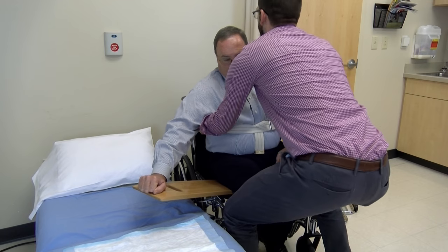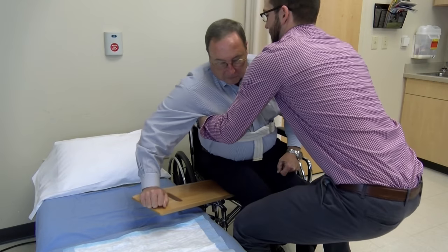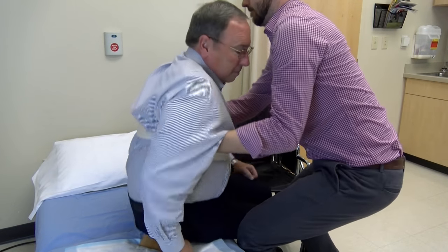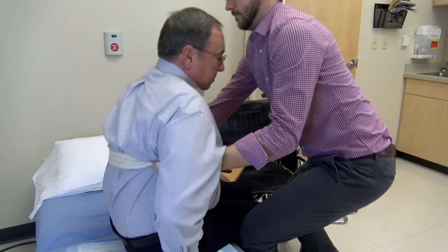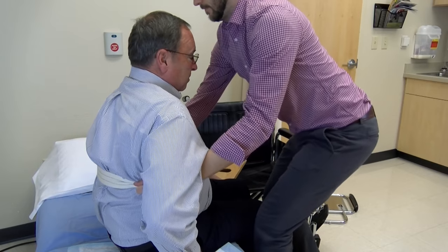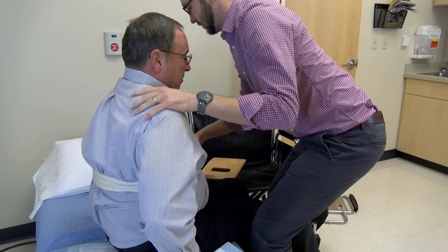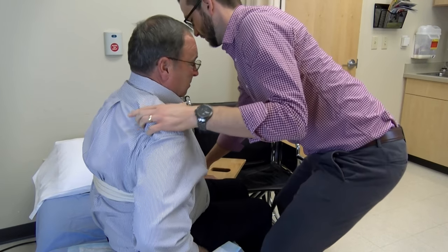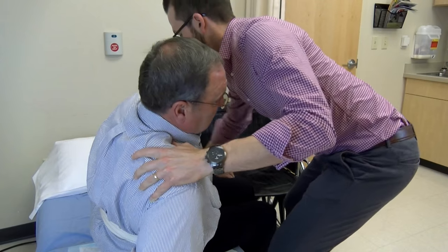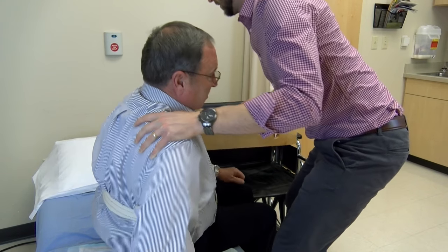Stand in front of the patient with a hand on either side of the gait belt. Squat to use your legs to help the patient slide across the board. Do not twist your back. On the count of three, help slide the patient slightly onto the board. At the next count of three, slide again until the patient is safely on the table.